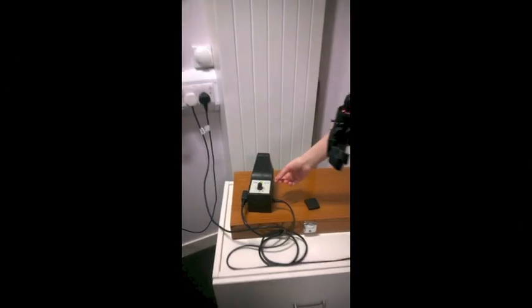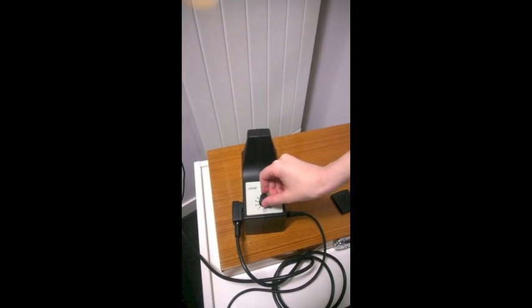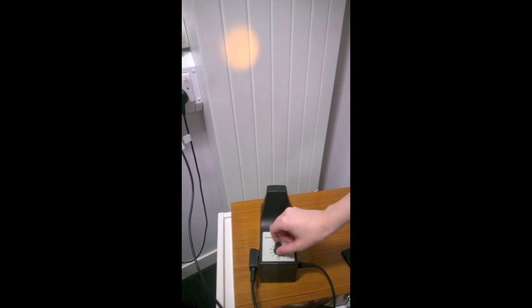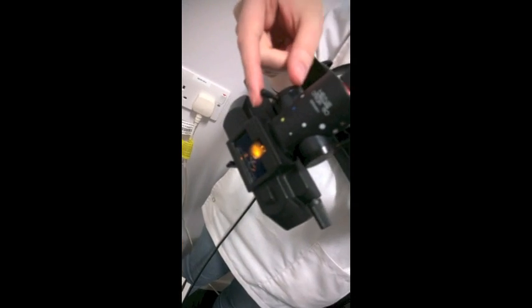The brightness control is a rheostat on a separate unit, as shown here. You should warn the patient that the light will be very bright but is not going to damage their eyes in any way. The headset has a few filter options which you can choose from by adjusting as shown here. One of the options is a red-free filter to give better contrast of the vessels.